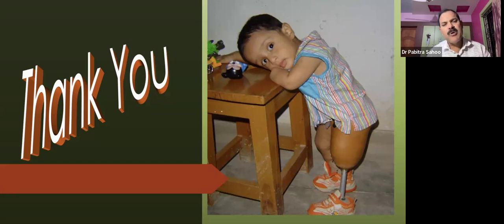That's why in a case of transfemoral amputation, when you are planning an AK amputation, it is better to go for the supracondylar area, keeping 2 inch space for accommodating the mechanical knee, so that the mechanical knee will correspond to the anatomical knee. If the stump is too long to accommodate the knee joint, you may have to go for a constant friction external knee joint, which can be adjusted to the normal anatomical side.